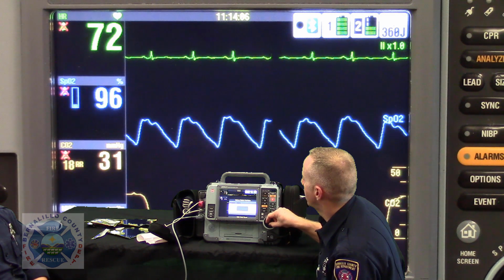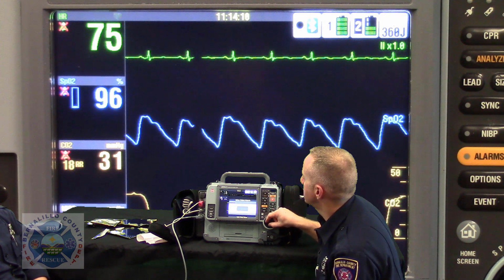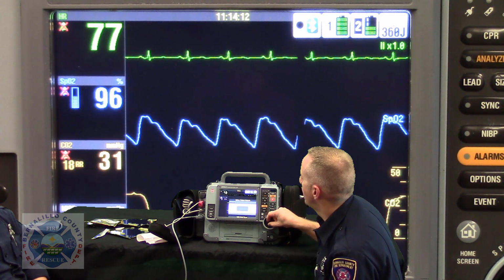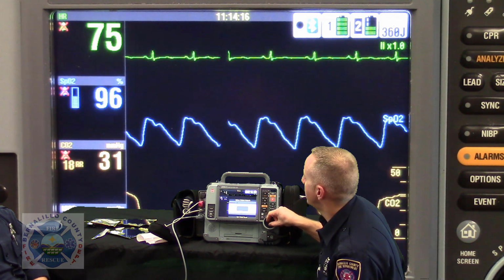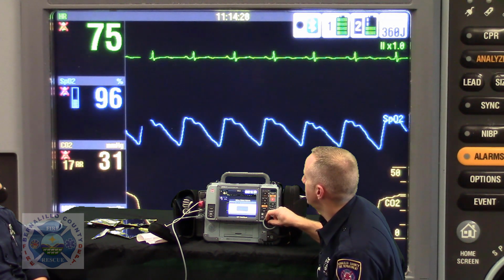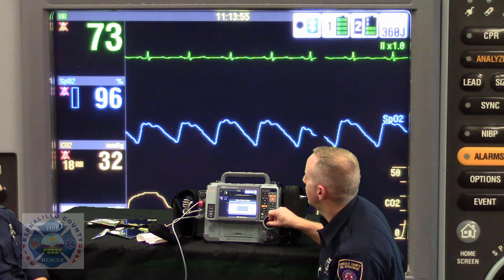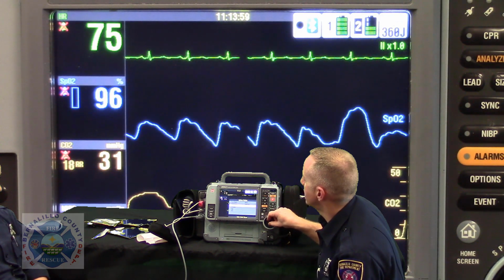You got it. Correctly spelled. Date of birth, please. 1/31/81 with dashes, 1981. Verify the patient's date of birth is correct.